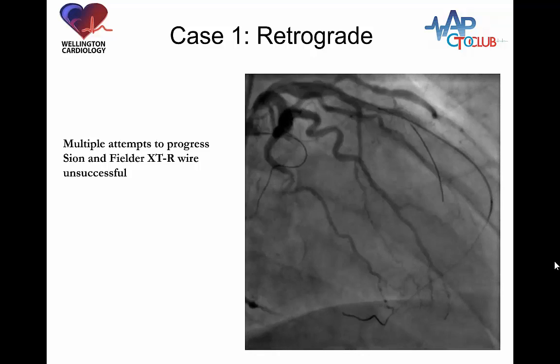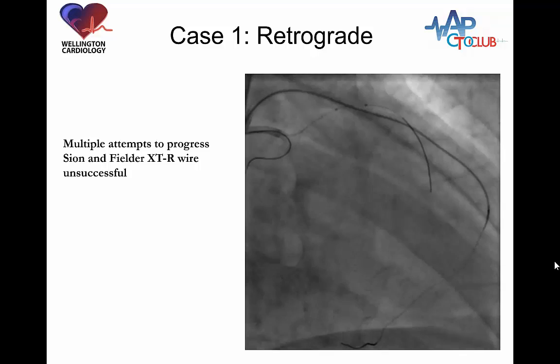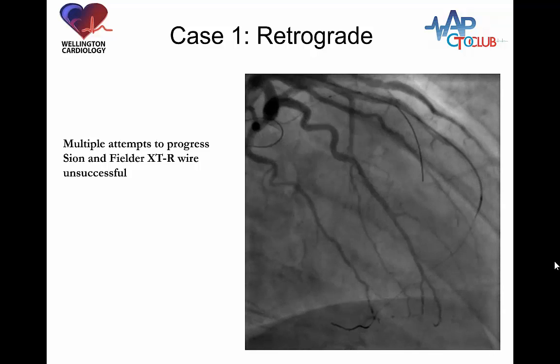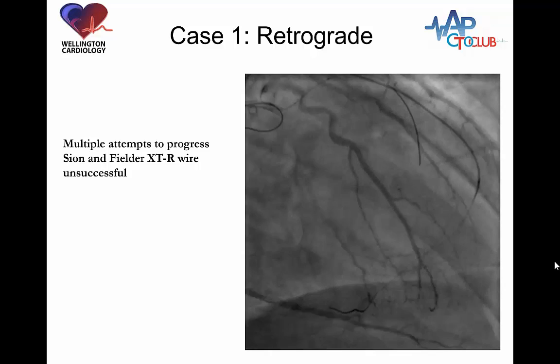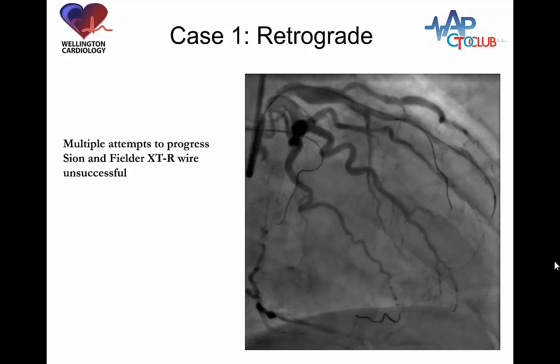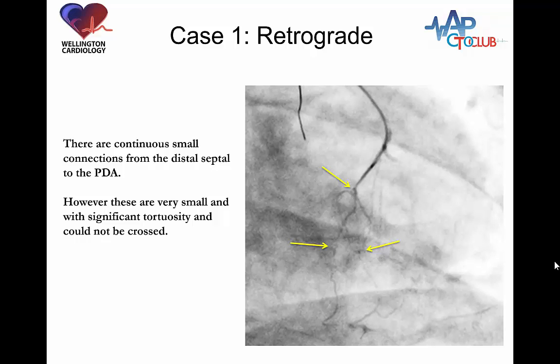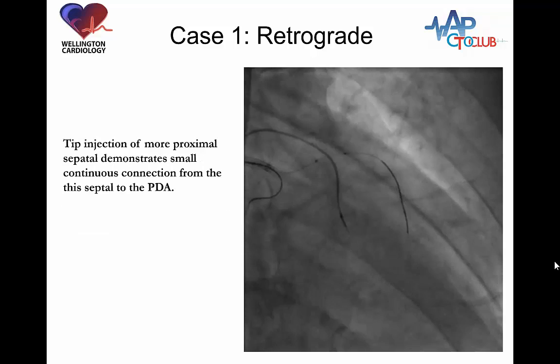We tried with a Sion and then an XTR wire to wire these collaterals and made some progress. But a retrograde injection demonstrates the wire is not in the distal true lumen. It's very important to perform the retrograde injection to confirm the position of the wire before advancing the microcatheter. Examining this collateral, there is a lot of tortuosity and it was unlikely we were going to succeed. We tried for about 10 minutes, but could waste a lot of time with further attempts, so it was time to move to another septal.